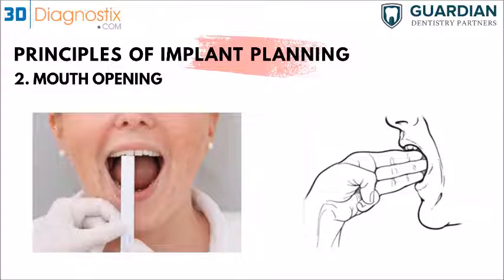And with guided surgery especially, this is going to be a bit difficult, because when you seat the guide in and try to place in a drill handle or a drill that is going to be, let's say, 15 to 20 millimeters long, if it's that far back, you're never going to be able to drill or access the site with the drill if the patient has a limited mouth opening. So this is really important information before going in and deciding to place an implant there, because if you know that information, we can actually work around it. So either try to place a shorter implant, use shorter drills, or lower the sleeve as close to the tissue as possible, so as to avoid having this complication at the time of surgery.